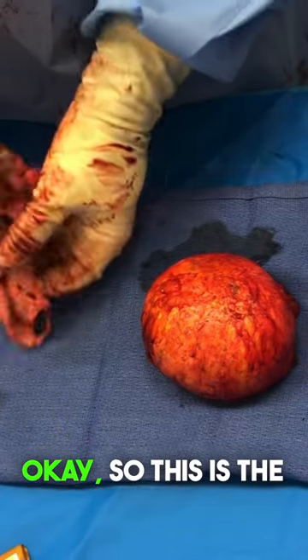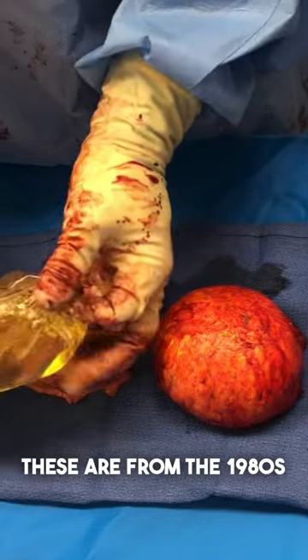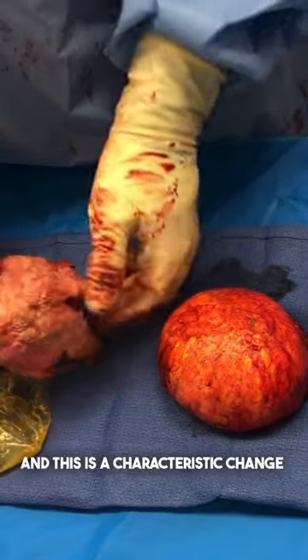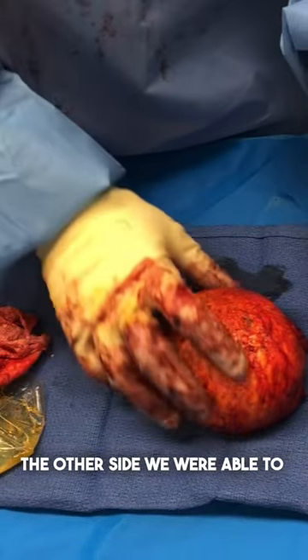This is the capsule — a ruptured silicone implant from the 1980s. This is a characteristic change visible on the inside of the capsule. On the other side, we were able to get it out intact.